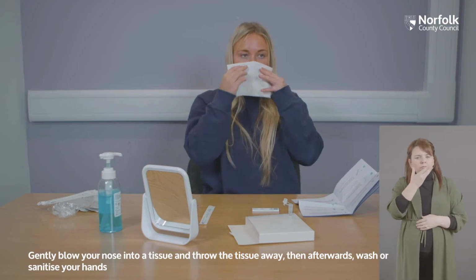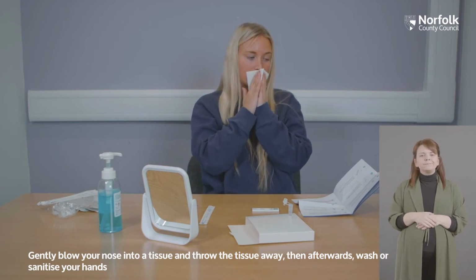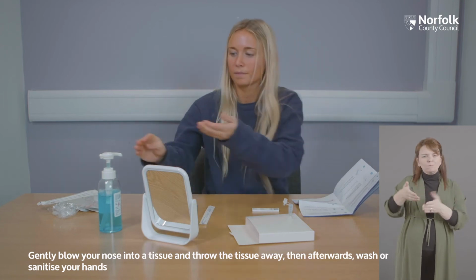Gently blow your nose into a tissue and throw the tissue away. Then afterwards, wash or sanitize your hands.